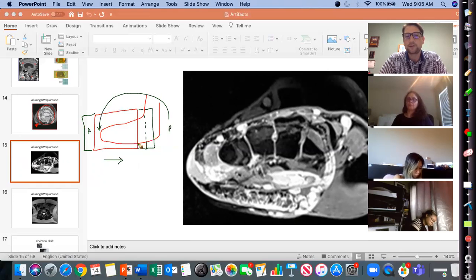But great question. So instead of 25%, maybe knock it up to 50%, so that I get the combination of the two 25s and then this, and then that basically goes all the way out to here. And then there's nothing back here, right? It's all just air. So there's nothing that's in danger of wrapping into our image.